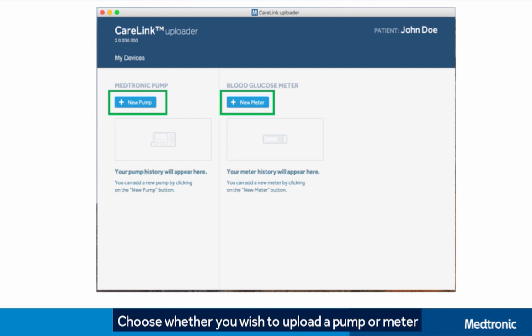Choose whether you wish to upload a pump or meter. In this example, to upload your pump, click Add New Pump.